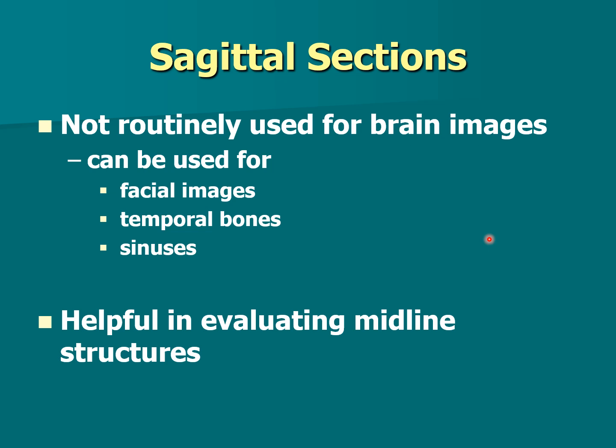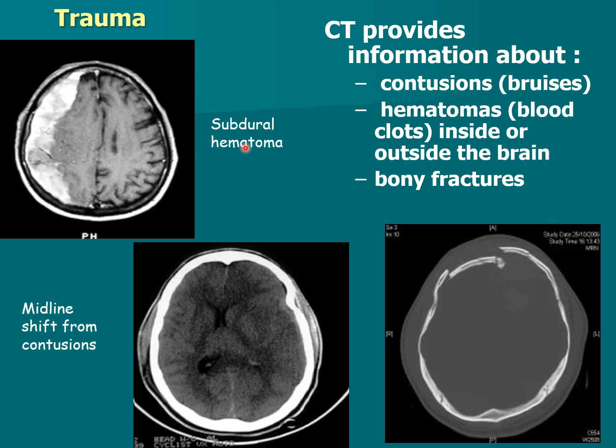But it's good for facial images, temporal bones, and for the sinuses again. It's helpful in evaluating anything in the midline structure. Is it going past the midline or a shift?